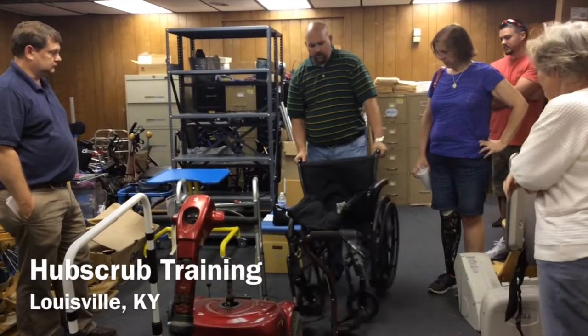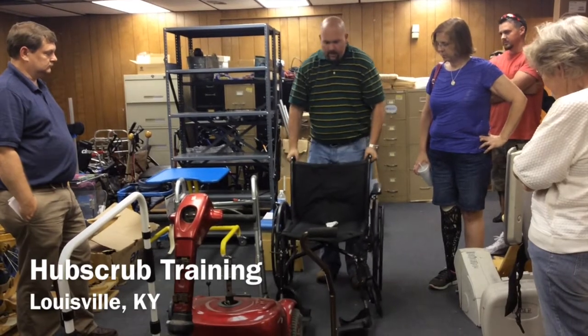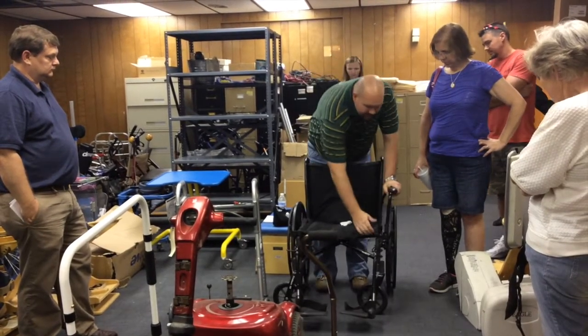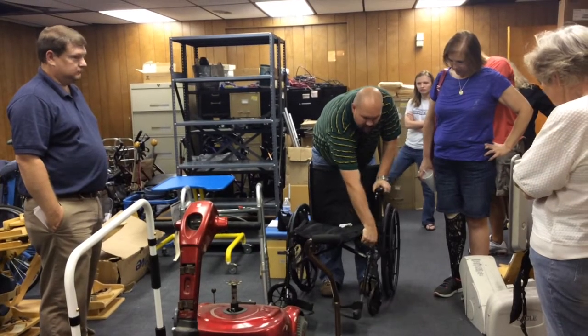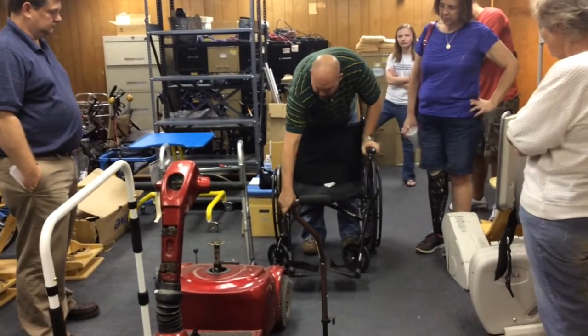There's a wheelchair. You're going to look for operation — make sure it goes out, it's dirty, safe. The legs are loose on this one. They broke. That one, the weld's broke right here. You guys see that? I think it's going in the garbage.